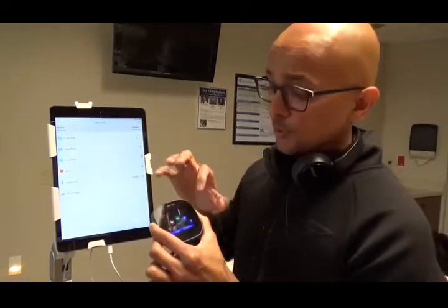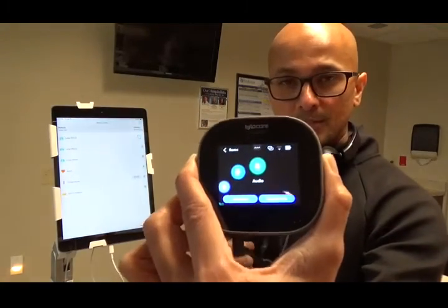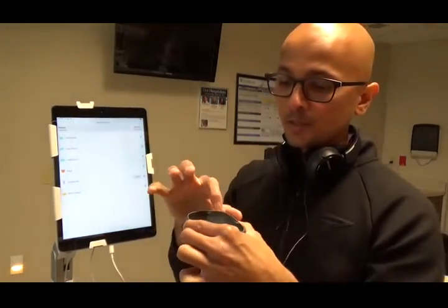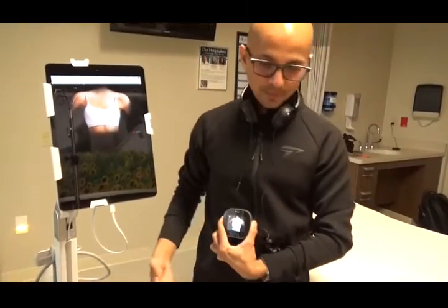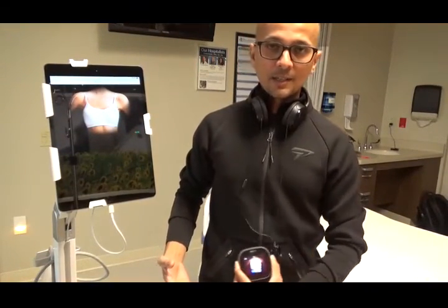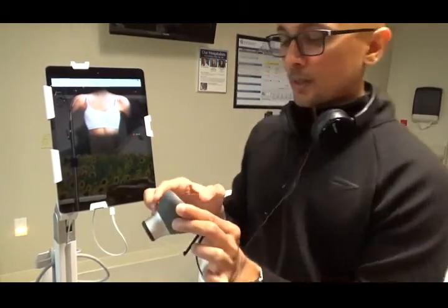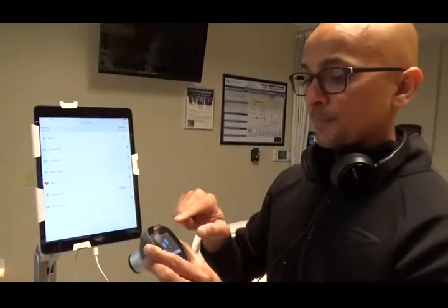And let's say you wanted to do the belly. The last one just says audio because that's general. You could use that for any abdominal auscultation. So there's no necessary place. You just go ahead and auscultate, right? And kind of let them know. And once you're done, you're done. So that's also being recorded.